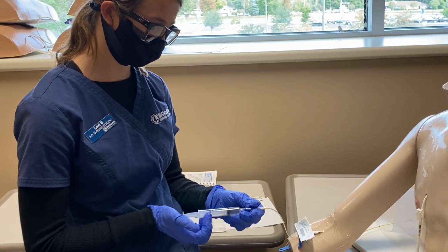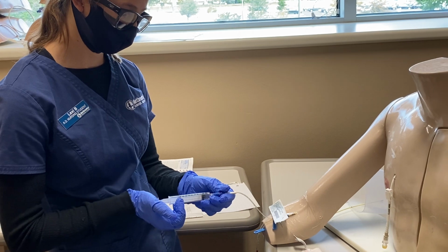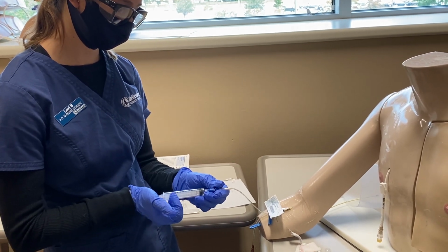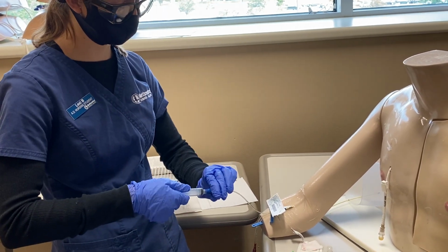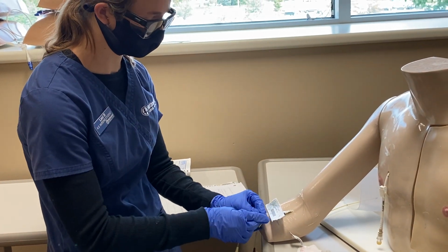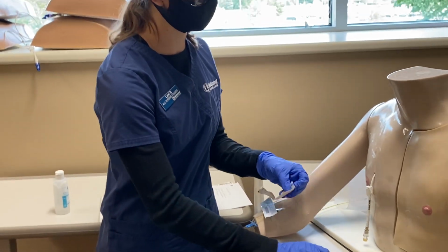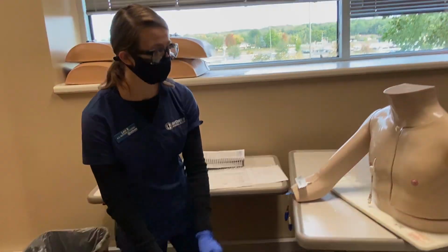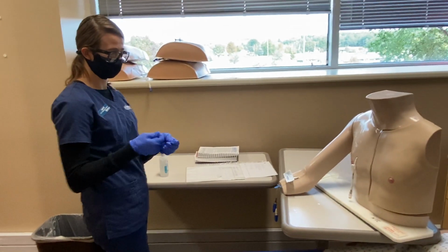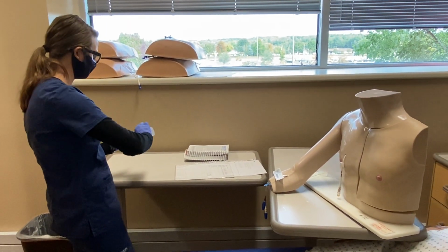So you can see it's covered. I'm going to go ahead and check for infiltration, any tenderness. Do you feel any pain? And then I'm going to reclamp this. There's none. I would take care of all my supplies. How are you feeling, Mr. Owens? He says he's feeling fine, so I'm going to go ahead and take off my gloves and wash my hands.